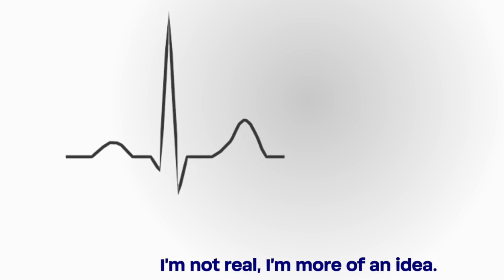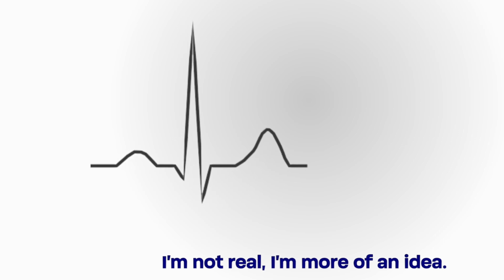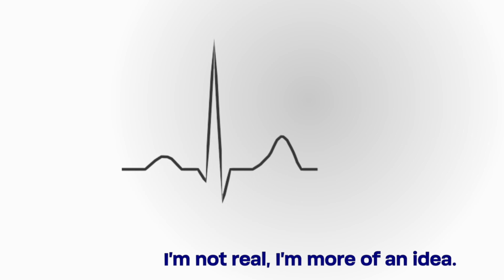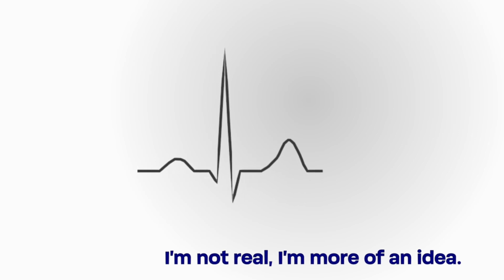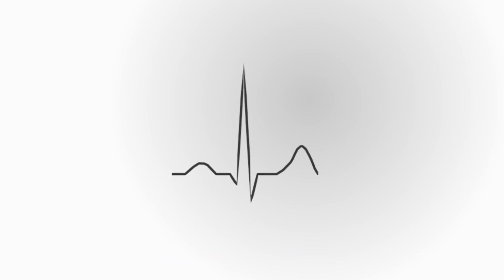As a quick aside, an actual QRS complex with all three waves is pretty uncommon to find. I dug through my collection and I couldn't really find a good example that actually looks like this. It does happen, it's just not very common. The point here is that this is a theoretical tool for naming the pieces more than a reflection of what the actual distribution of waves looks like most of the time in real people. You'll get used to that pretty quickly, and I'll start introducing more real tracings soon.